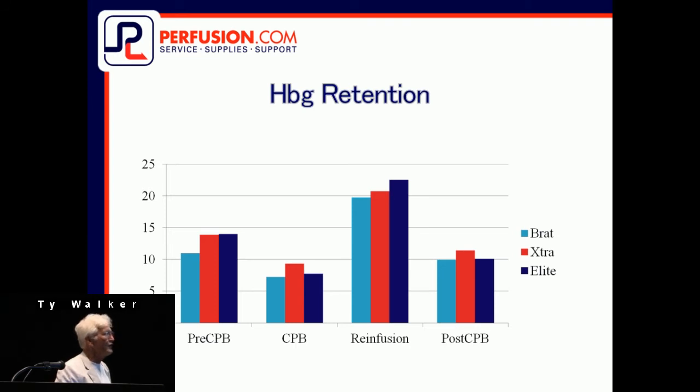But look at our reinfusion product. And again, what could you have done? You could have gotten the same result by what? Washing all your pump blood? You would have gotten a high hemoglobin, correct?